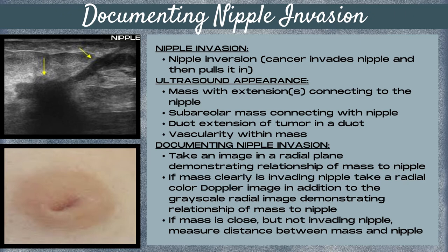If the mass is close but not invading the nipple, then you want to measure the distance with the calipers between the mass and the nipple. This communicates to your radiologist that you don't see a clear extension of the mass to the nipple and shows how far away it is on the ultrasound. Note there can be tiny spiculations we can't visualize on ultrasound — this is just saying that visually there's no obvious connection seen.